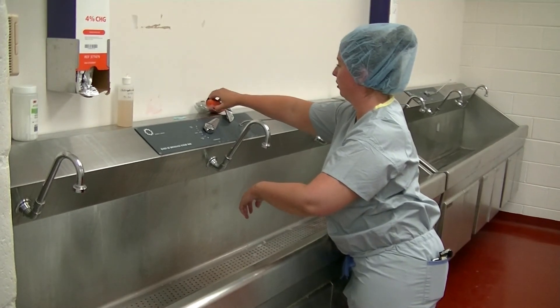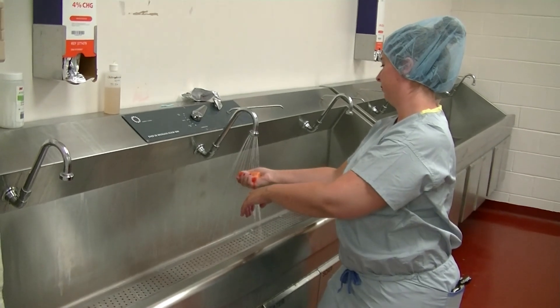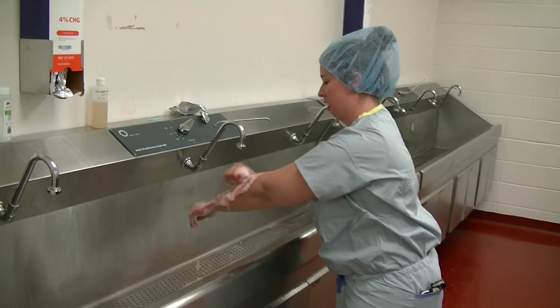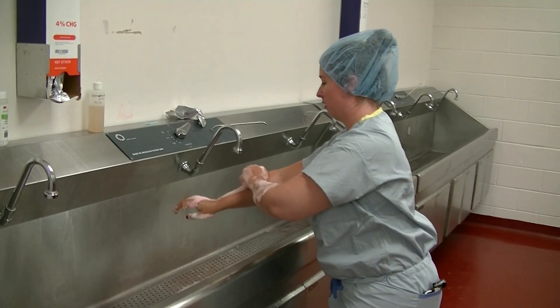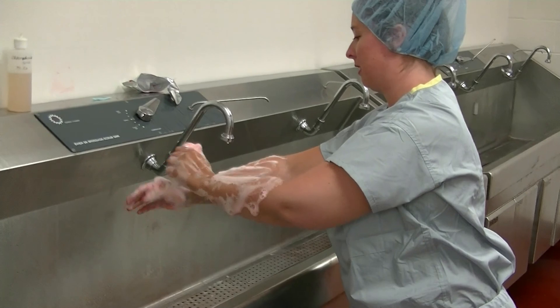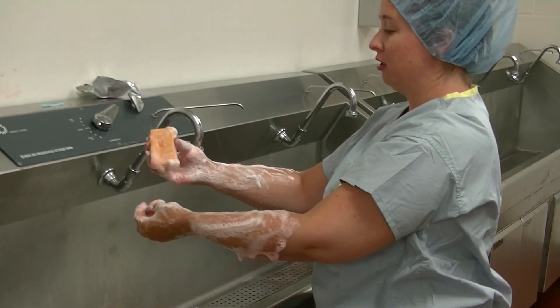With your hands wet, take your scrub brush and get a little lather with the water, then squeeze out a good lather all over both arms and hands so that you have five minutes of contact time of the soap on all of the skin that needs to be cleaned.